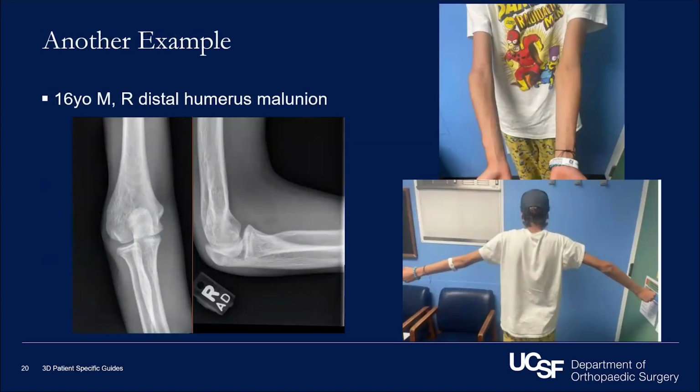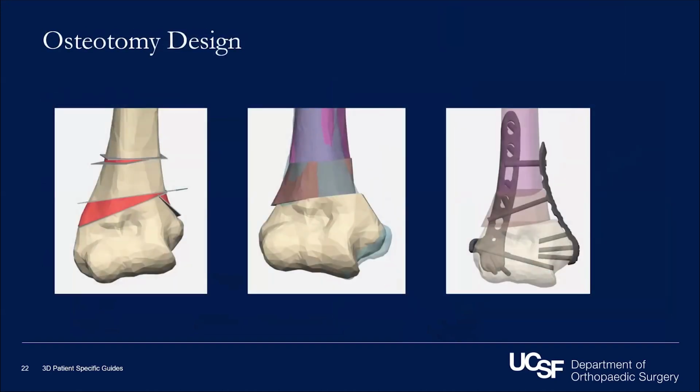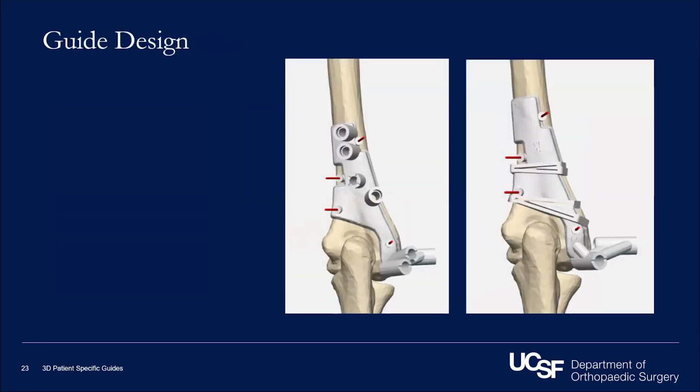Here's another example. This is a 16-year-old with a distal humerus malunion. You can see the cubitus varus very obviously, but it's hard to appreciate the rotation. So when we scanned them and did the analysis, you can see there's a 50-degree malrotation compared to his contralateral side. Obviously there are different ways to do this, but this technique allows us to really make it anatomic and actually make it look nice on x-rays. So we designed a double osteotomy, taking out wedges. We shortened him a little bit, but we're able to correct the rotation. Here are the guides that we designed for the drilling and cutting.